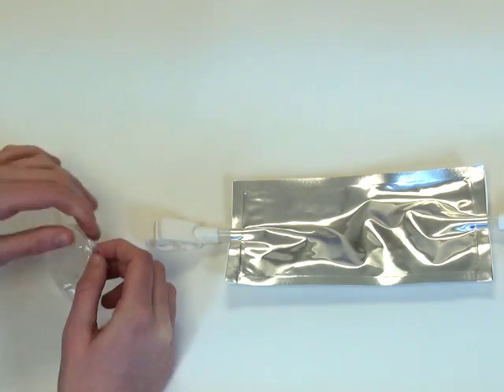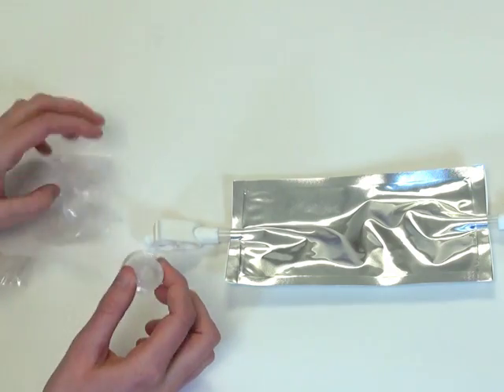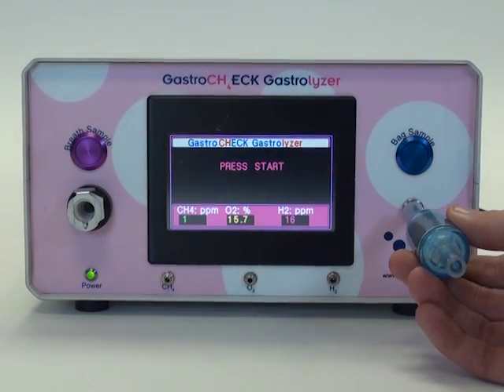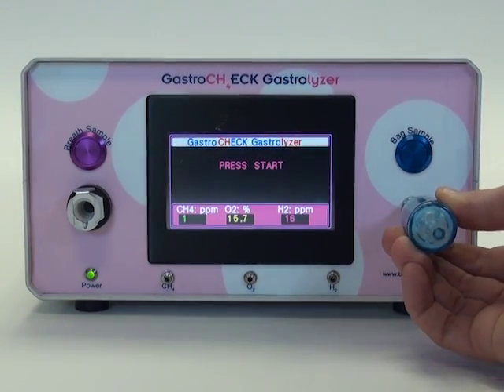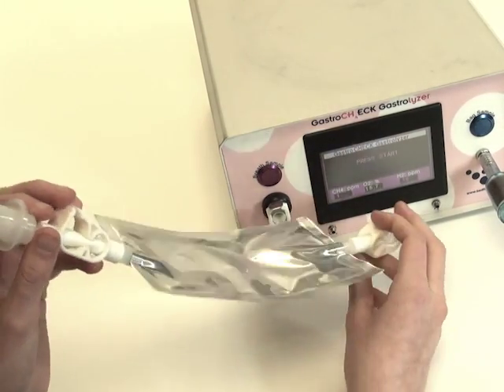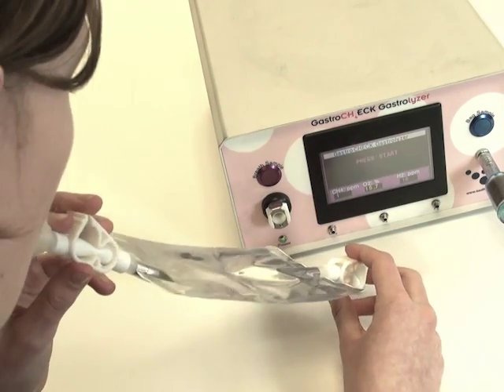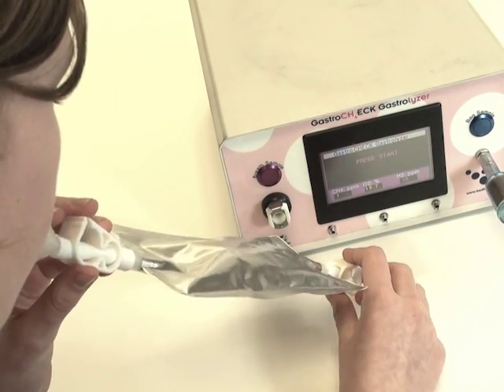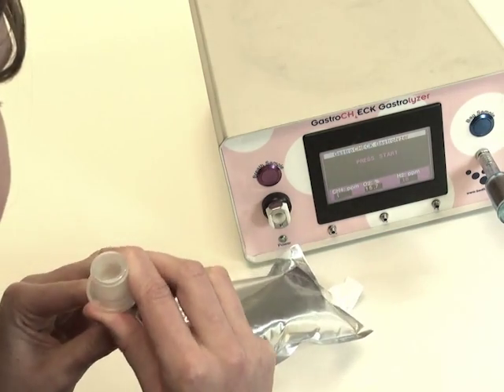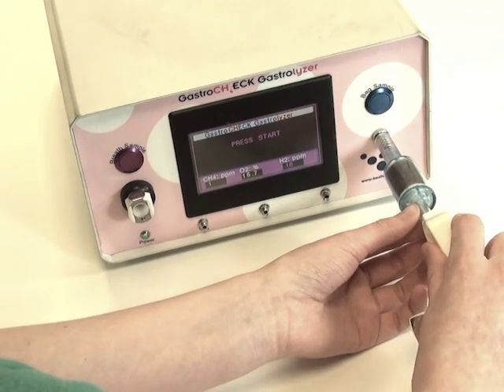A breath bag mouthpiece is then opened by the patient and placed onto one end of the breath bag. Don't forget to place the moisture filter onto the monitor before the test. The patient should blow through the bag with both clamps open until they reach their end tidal breath. As they reach this, they should press the clamp down while still exhaling to trap the end sample. The top clamp can then be closed and the mouthpiece taken off. The breath bag can then be placed onto the moisture removal filter, the clamp at the top released, and the breath bag sample button pressed.